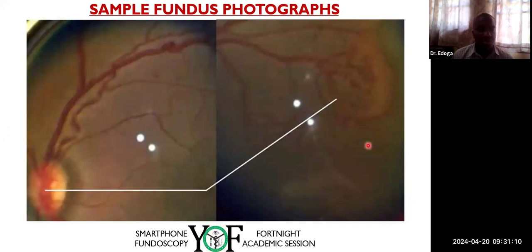I will also show us in part 2 how to do montage. So I now drew a line. This line is the line from the center of the macula to the center of the disc. So you now have the zone 1. Then from that center of the macula, the same diameter, so we now have the zone 2. So you can see this ridge.